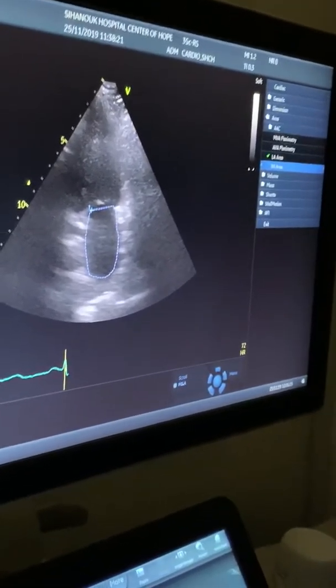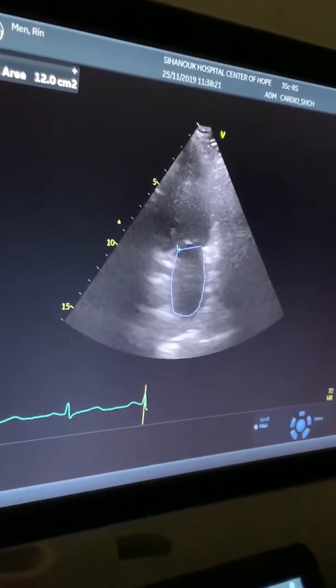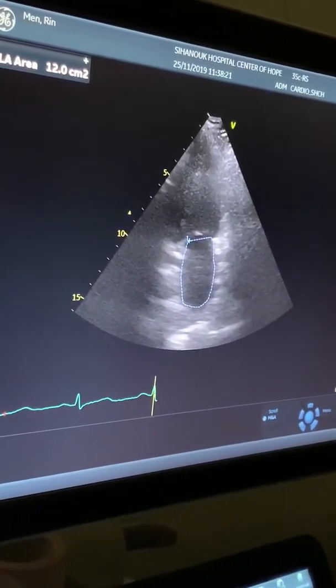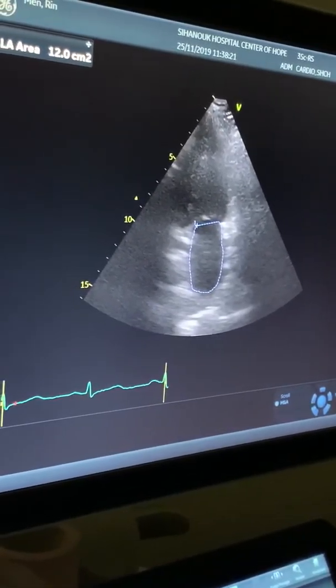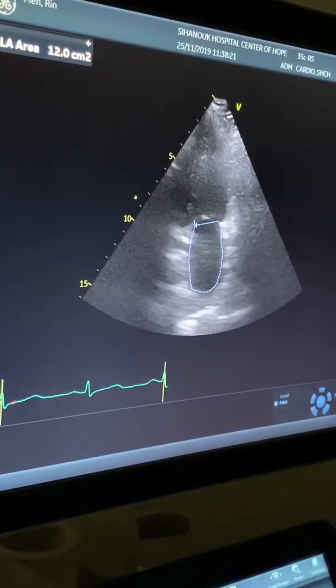Oh, we don't have the mitral valve area on. Mitral valve. Which one, doctor? That's the planimetry. If you got a small mitral stenosis, you can use either of this one. This is left atrial area. You trace it like this. It's not the volume. If you got MR and you measure that one, that is the dilation of volume. Or sometimes the MR versus the left atrial area. No, this is left atrial area.